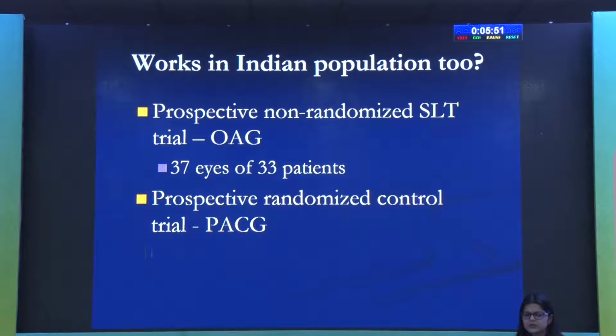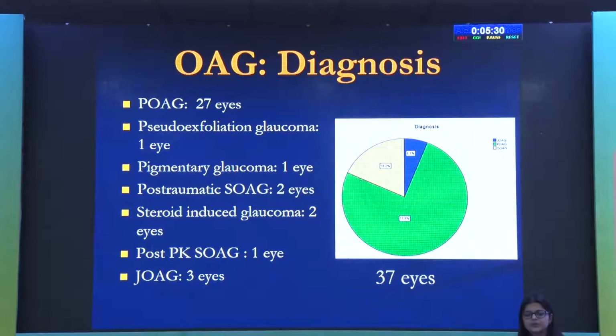So we did a couple of trials, both prospective. One was non-randomized, where we treated patients who were already on medical therapy and gave SLT to them. There was also a prospective randomized trial in relation to angle closure glaucoma. I'll just share some data on these trials with you. This was the open angle group.